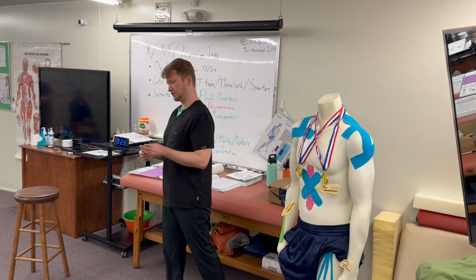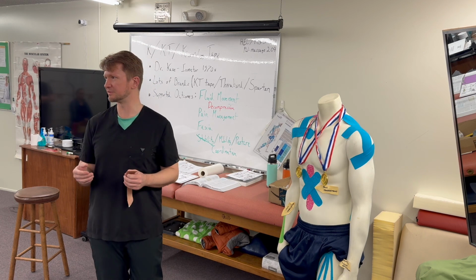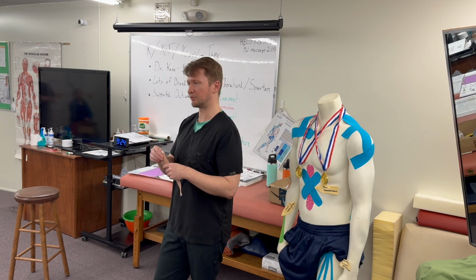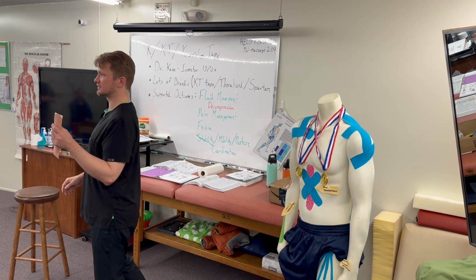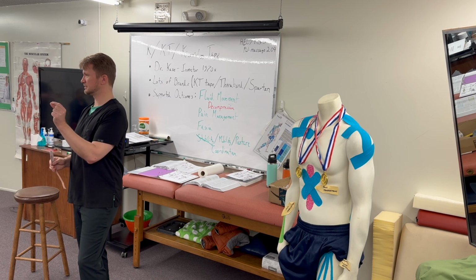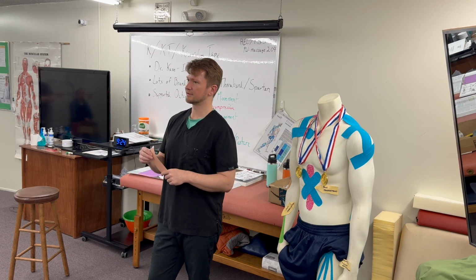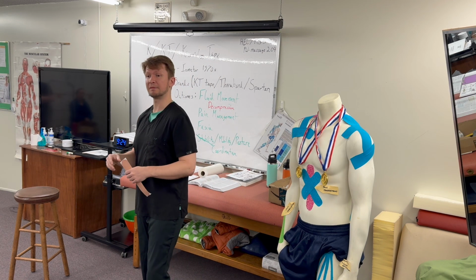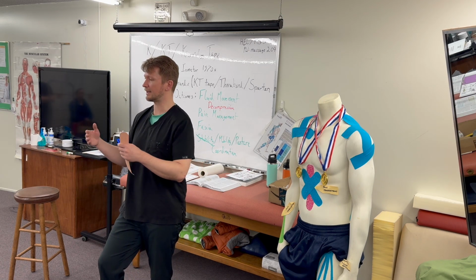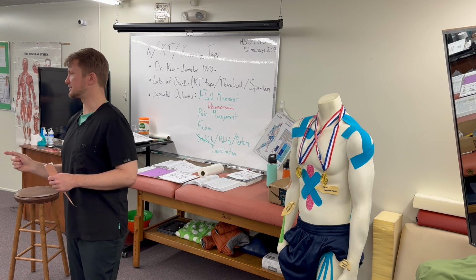It's more about when we tape around joints, it's more about helping more efficient movement, more coordinated movement. It can be that, and I'll get into the actual terminology about why this works, but the sensation of the tape can help a person feel that area of the body maybe with a bit more precision. And so everything from posture correction to better movement during rehab or exercise. The reason can be the tape is there, you're feeling the tape, and either it's a reminder to hold your body in a better orientation, or maybe you're getting some additional feedback in that area of your body. So as you're doing the movement, you can just get slightly better adjustments neurologically.